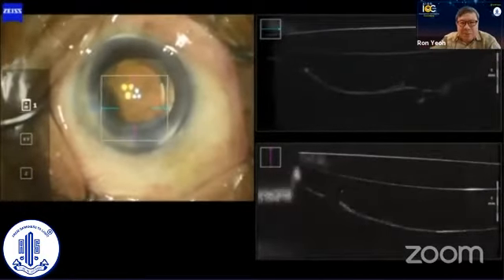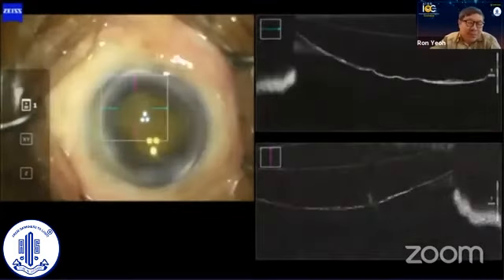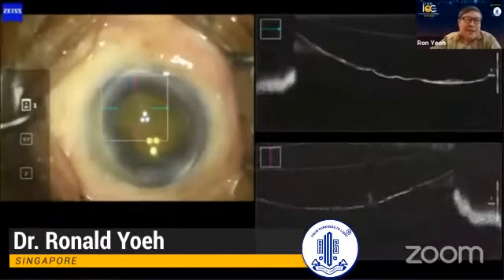And when I got that, I was saying, gee, okay, now I know we can see the posterior capsule. Let's wait for a real PCR to happen. And of course, having commented that I haven't seen a PCR for a few years, then I had a run of a few.